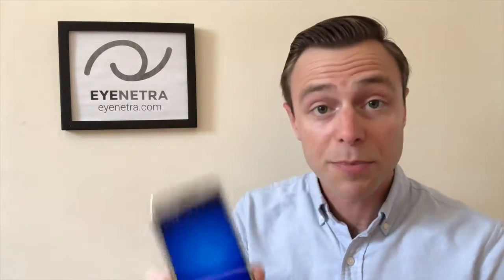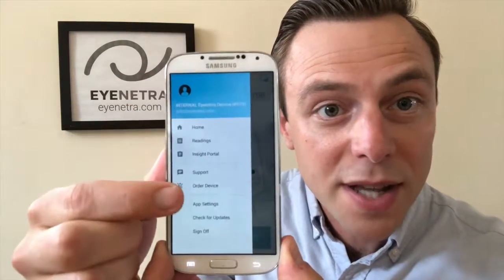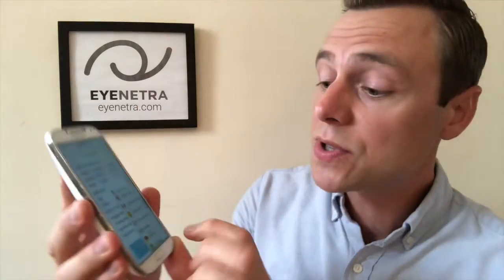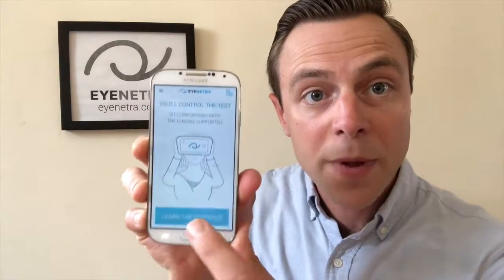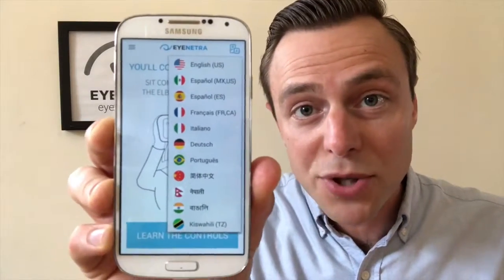Both the Netra Auto Refractor and the Netrometer Lensometer applications come in a variety of different language settings. If you'd like to change the language, you can simply open up either one of the apps, select the drop-down menu in the upper left-hand corner, select App Settings, and then you have a variety of different language settings to choose from. You can also do the same thing in the Netra Auto Refractor by selecting Tutorial and then selecting the language icon in the upper right-hand corner, where you'll have a variety of different language options to choose from.